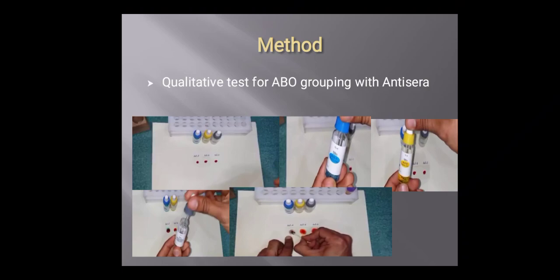Take three separate drops of blood on a glass slide then pour one drop each of anti-A, anti-B and monoclonal D on each drop of the blood respectively.